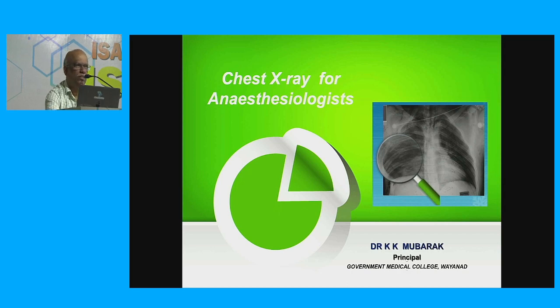As a part of pre-anesthetic evaluation, even a child with a known cardiopulmonary disease should have a chest X-ray, but not as a routine for all patients. A grade 1 patient coming for an inguinal hernia repair at 21 years need not have a chest X-ray. It's harmful for the patient. And in critical care, you have to take X-rays. Maybe you have to take daily X-rays, or in the operation theatre, when a major event occurs, you may have to go for a chest X-ray. We'll go one by one.